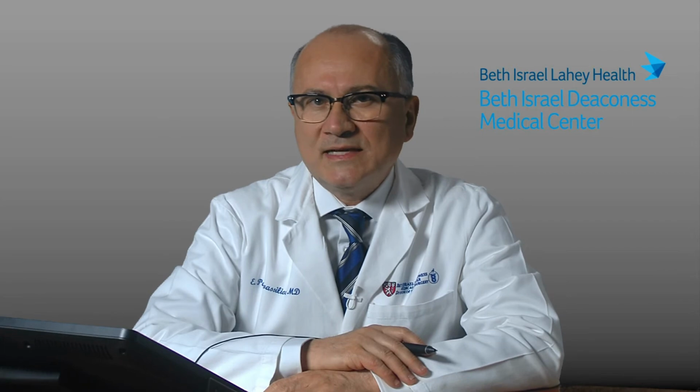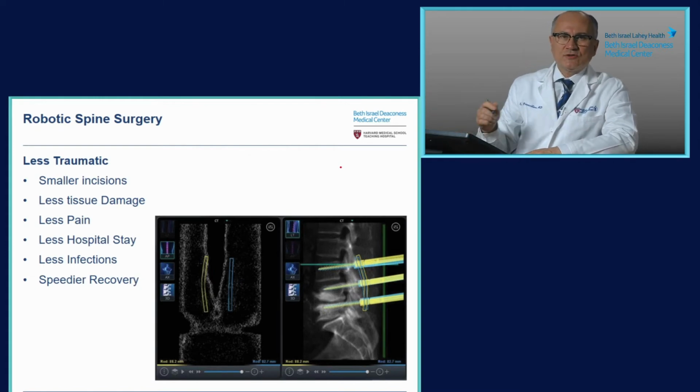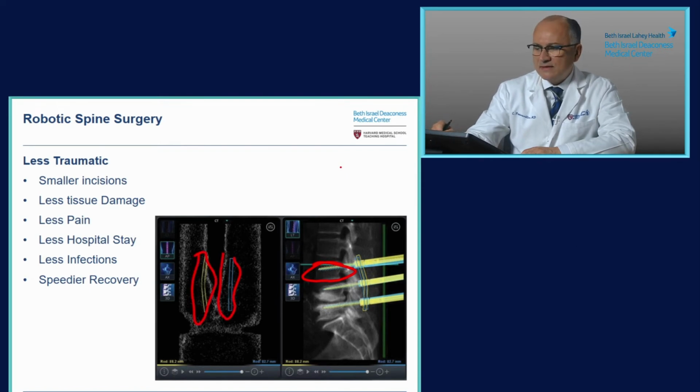Why do we select to do robotic spine surgery, whereas traditional methods have been overall very successful? The big advantage of robotic spine surgery is that it allows you to pre-plan your actual procedure, especially in regard to the hardware placement. Robotic spine surgery in association with navigation allows you to pre-plan the depth of the hardware, the length of the hardware, as well as the orientation and angle of the hardware. It will also allow you to plan the rods, the length, as well as the angulation of the rods.